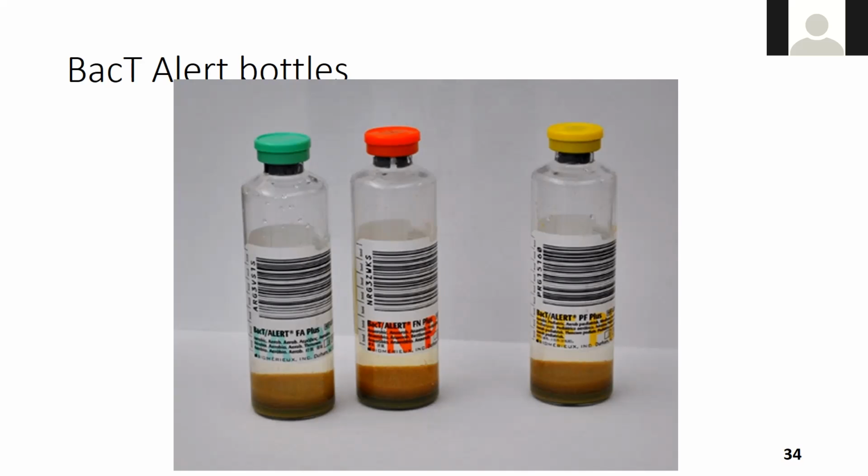So is it aerobic or anaerobic? Get one of each. Oh, when you do the pedi, it's just aerobic. Yeah, you're just stuck with one bottle. They used to make them where, even if the patient was on an antibiotic treatment, they had a charcoal in there and it would absorb out that, so it was still okay to use it.